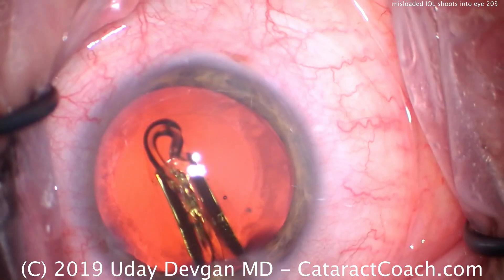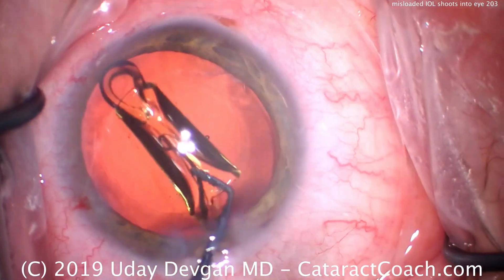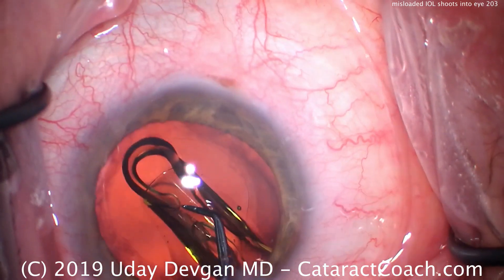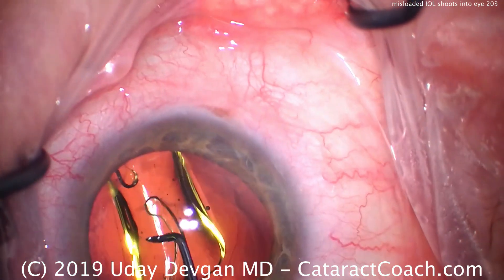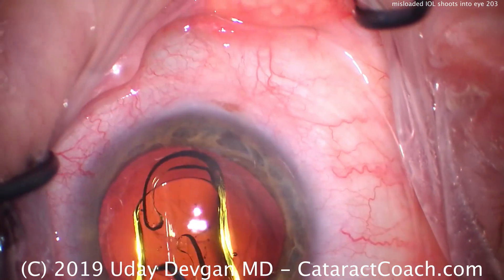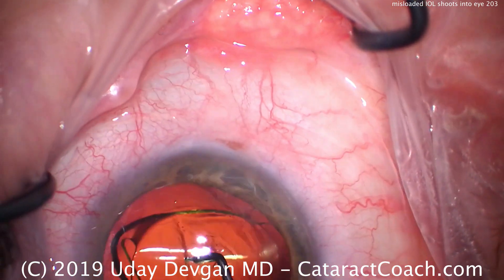Boom! It just shoots out like that. Why? Well, the lens was misloaded. There was not enough viscoelastic placed into the injector. So as a result, the lens did not glide smoothly down the barrel of the injector — instead, it shot out abruptly.